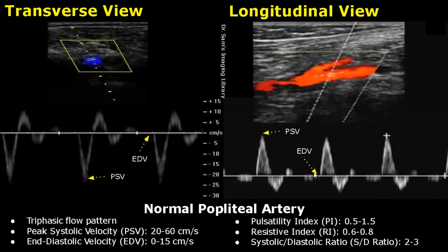This graph is the same as the other one, just with the opposite direction — the blood flow direction is opposite as compared to the blood flow in the other image. Otherwise, both waveforms are the same. The peak systolic velocity or PSV of the popliteal artery is between 20 to 60 centimeters per second, and the end diastolic velocity is between 0 to 15 centimeters per second.